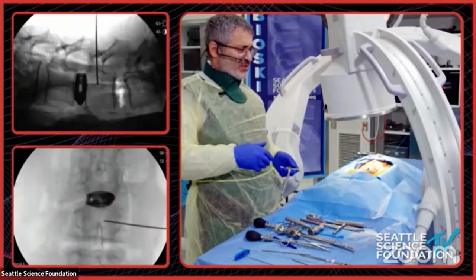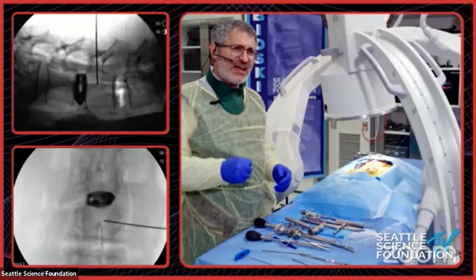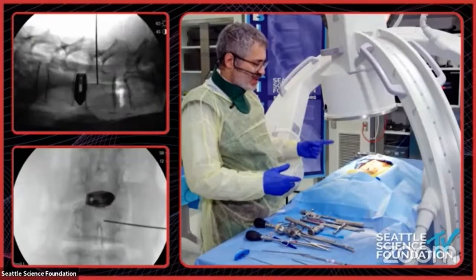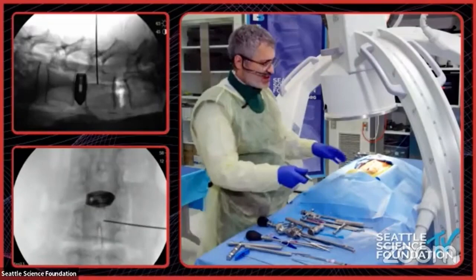I have surgeries recorded from beginning to end. If you watch the surgery from skin cut to the time the cage is in and the K-wire is in, it usually takes me on average about 7 to 10 minutes. Then I just have to replicate it for other levels and put the percutaneous screws in. I also wanted to show you the action of the decorticator — what we call the facet decorticator.